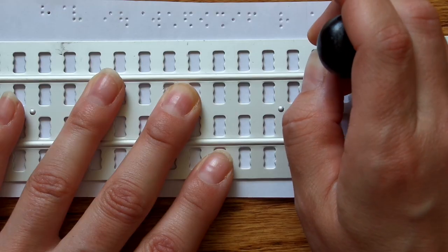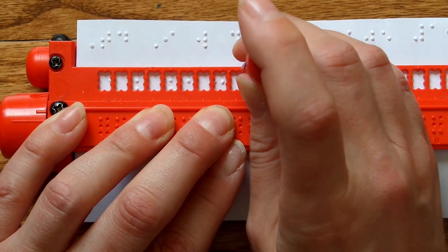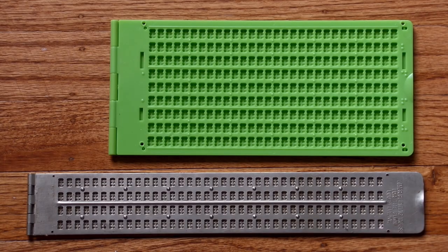Today I will demonstrate 10 different braille writing slates. A slate is a template for writing braille by hand. It's equivalent to using pen and paper.